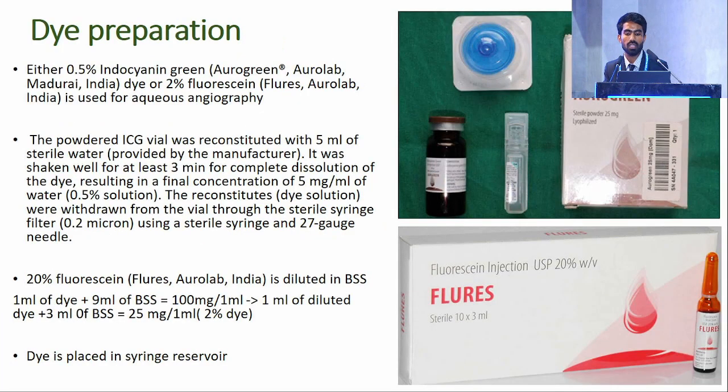For dye preparation of ICG, there is a solvent given by the company. You just have to inject the dye into the solvent.